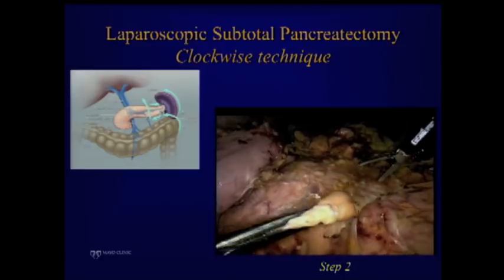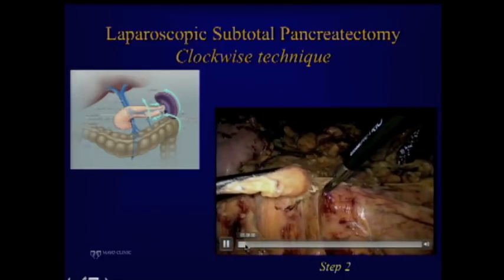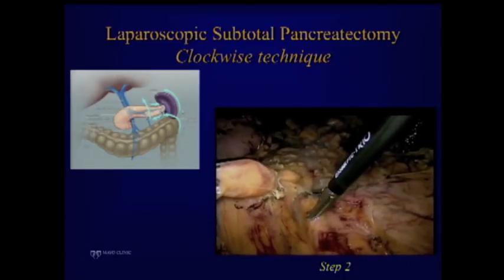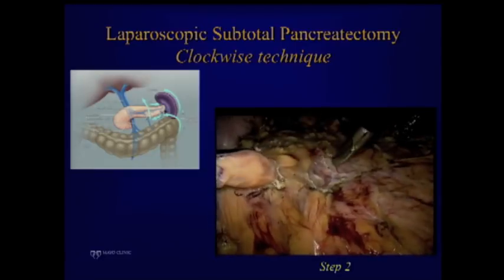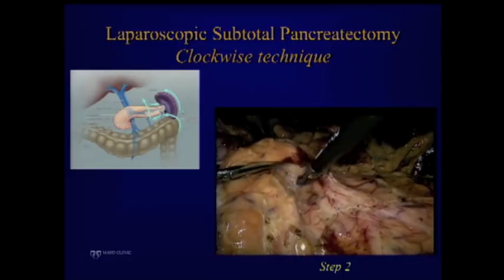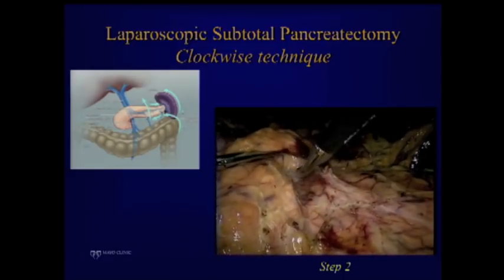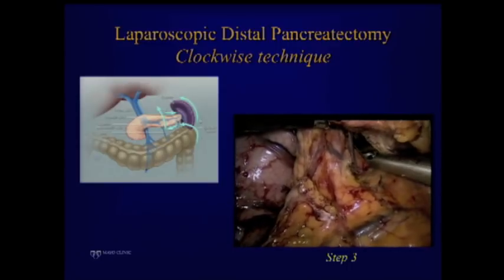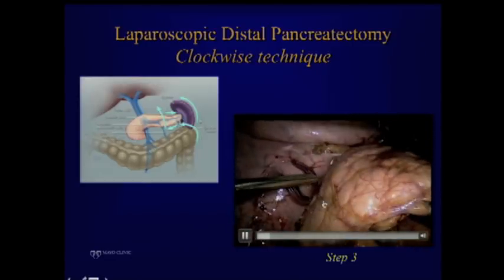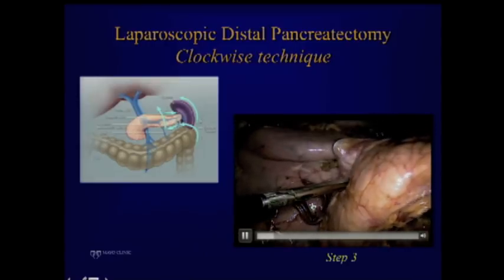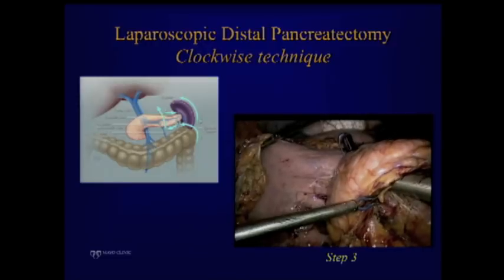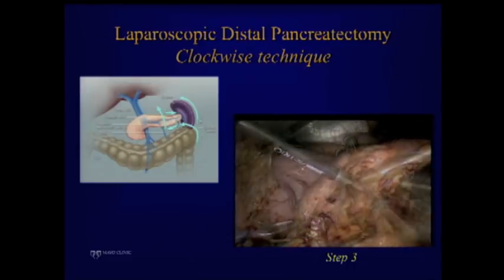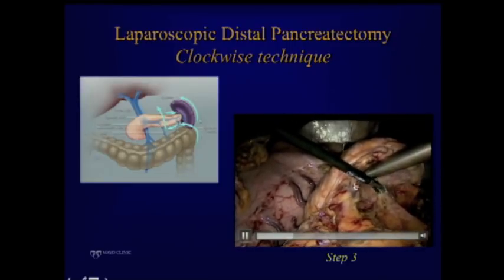Then you go along the inferior edge of the pancreas. You can choose how close to the inferior edge based on whether it's cancer or not. You follow the inferior edge from left to right down to where you want to divide it. For a distal pancreatectomy, you lift the pancreas and go around with the finger retractor. Contrary to what many authors say about needing to separate the artery, for a distal pancreatectomy away from the celiac trunk we include the artery within the specimen and apply the stapler.